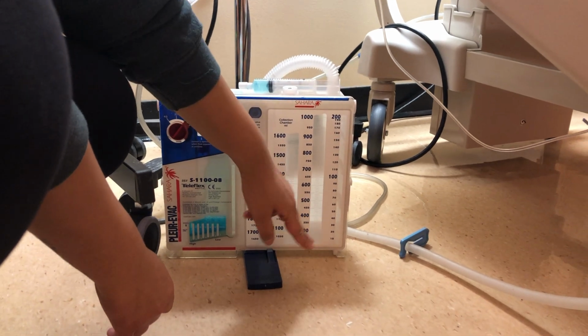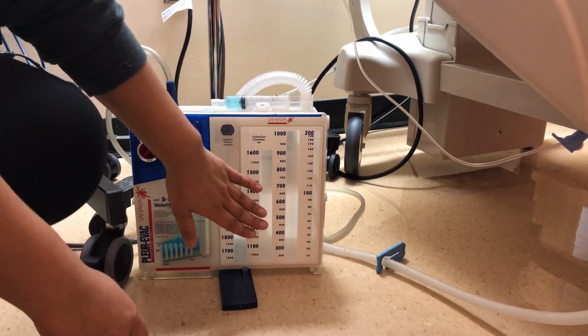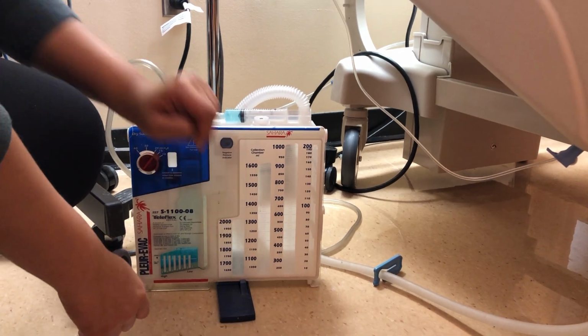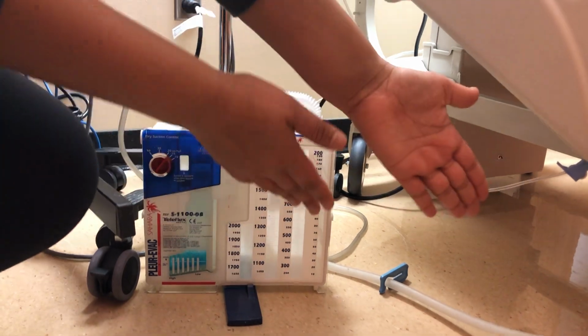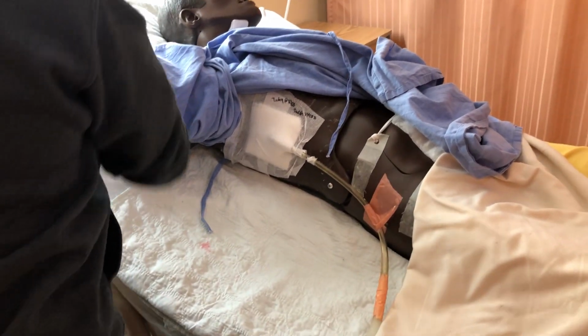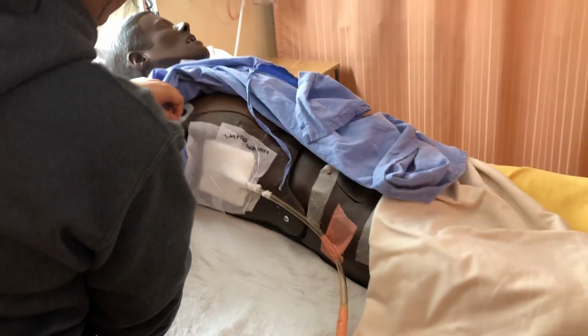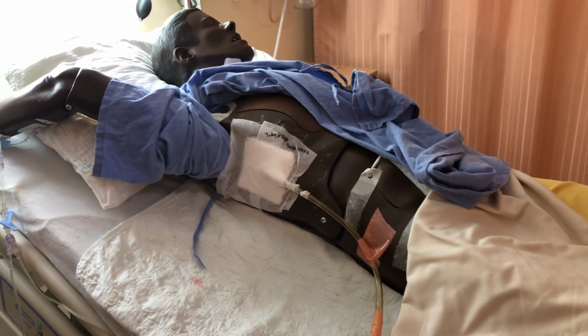I would also document the drainage at the beginning of my shift. I don't have tape right now, but I would do that. And then we're gonna follow the tubing up here, and look at my patient's site. So just moving their arm up. Alright, so that should not be attached to the patient.